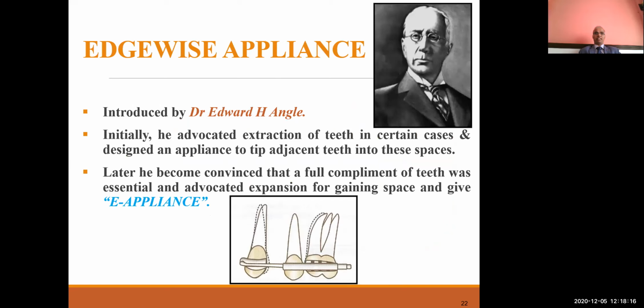First, edgewise appliances. Edgewise appliances were introduced by Edward H. Angle, who is the father of modern orthodontics. Initially, he advocated extraction of teeth in certain cases and designed an appliance to tip adjacent teeth into these spaces. Like this is a simple appliance.